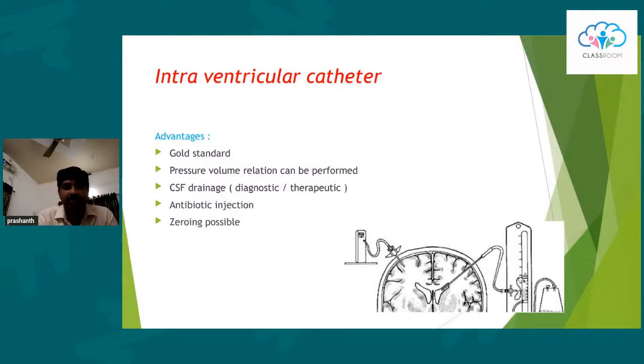The advantage here is that since you can have free access to the ventricular system, CSF drainage is possible, and you can also assess the ventricular compliance by looking at the pressure-volume relationship. It can also be used as a portal for injection of drugs like antibiotics, and in some cases thrombolytics, and repeated zeroing is possible.